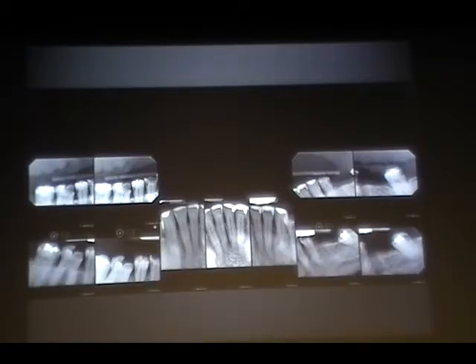Madeline, you helped us last week. This one's also missing the apex. Louder, please, we can't hear. I also can't see the apex in this one. And you will probably open up the contacts in between the molars. Okay. Good.